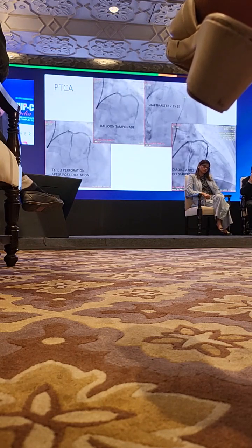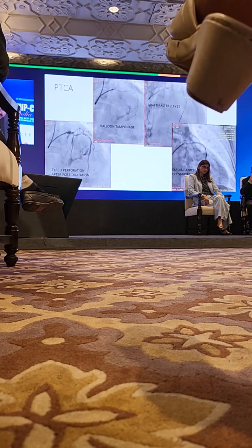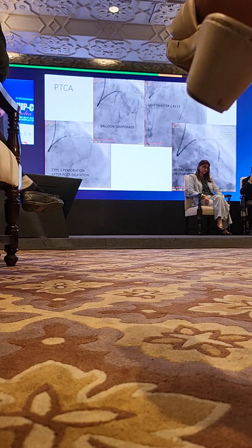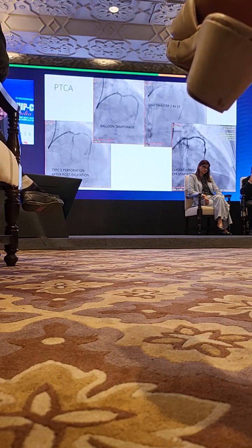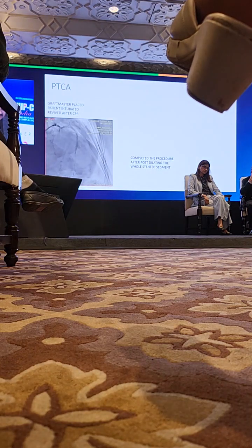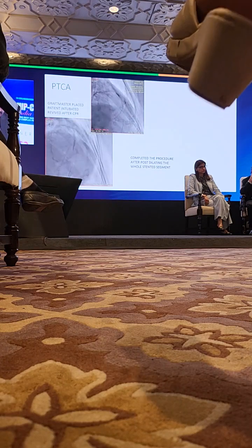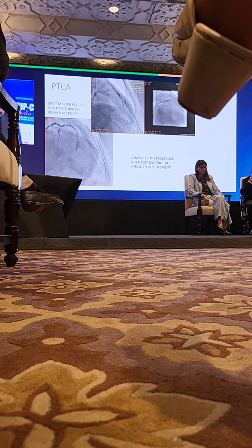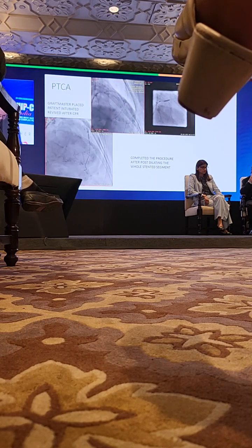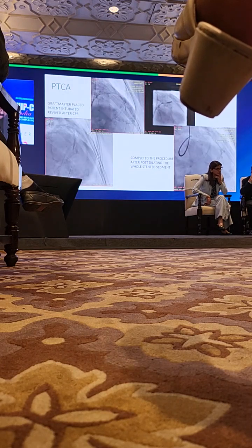The patient developed hypotension, had bradycardia, went into cardiac arrest. This is during the cardiac arrest. I placed the graft master and opened the graft master. And this is after the graft master, the perforation got sealed up, and okay, the result. And then I subsequently completed the procedure by doing the post dilatation with the proximal part of the stent.